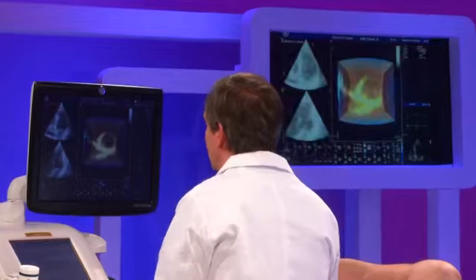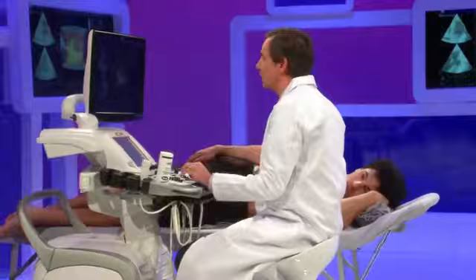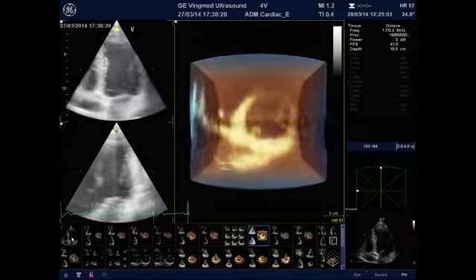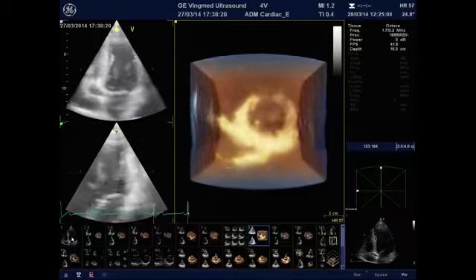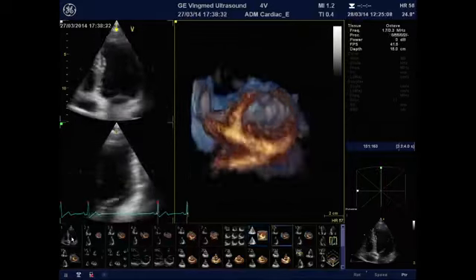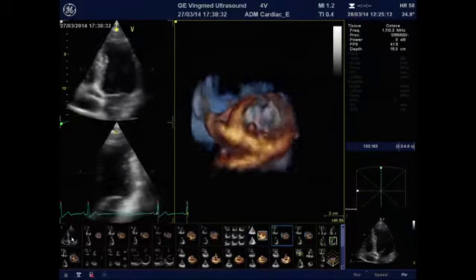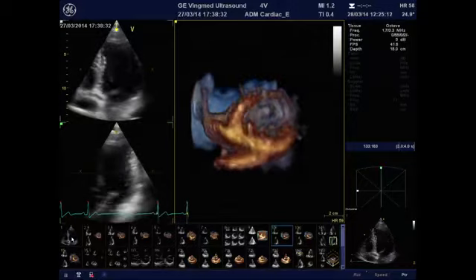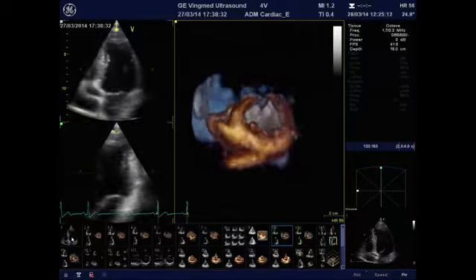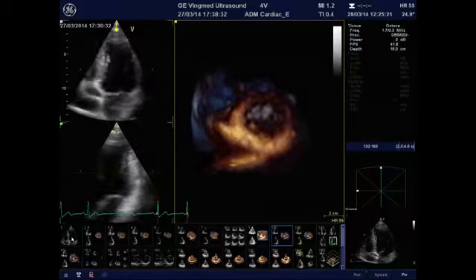Another important clue is, of course, to have the appropriate gain. If we use overgaining, we lose resolution, and we also lose the 3D perspective that we can get with this modality. The other way around, we can also undergain the image. This is quite dangerous because it means that we can have some kind of dropout. I will show you what problem we can have here.